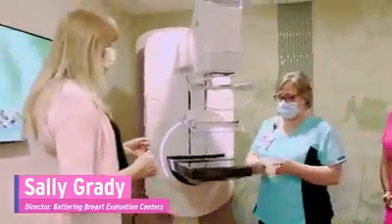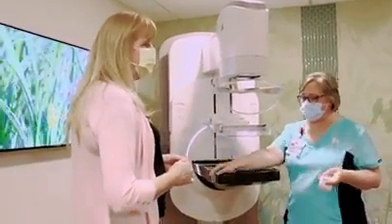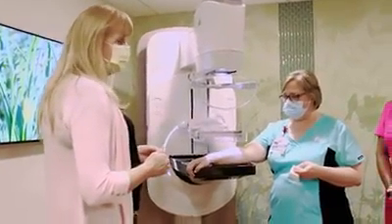Duetta is patient-assisted compression. What are women most fearful of when they come in for their mammogram? Getting compressed. Yes. So now you can help control it.